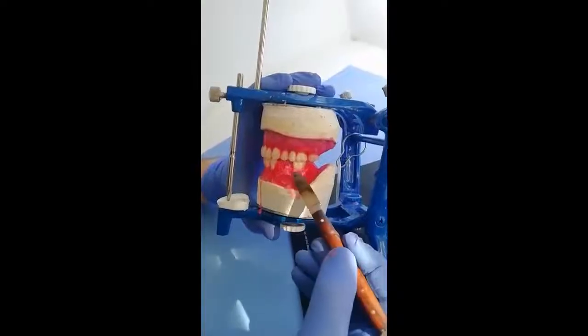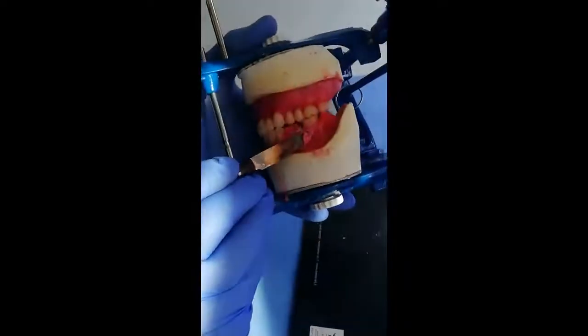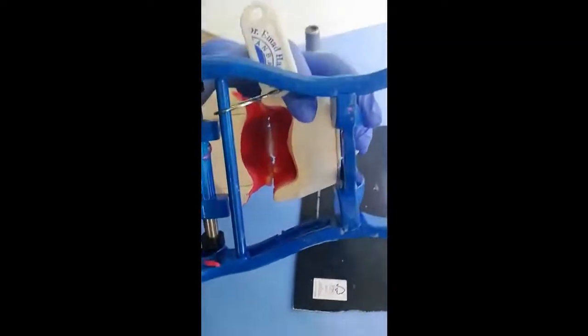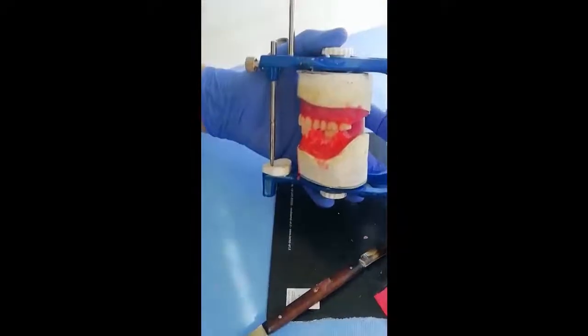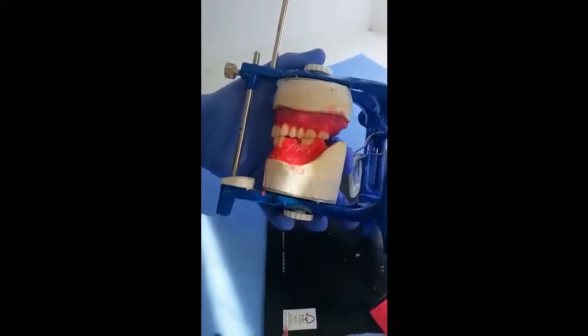We fix it in the wax, and also we fix it from the lingual aspect as well. We place some wax from inside and we wait a few seconds for the wax to cool down.